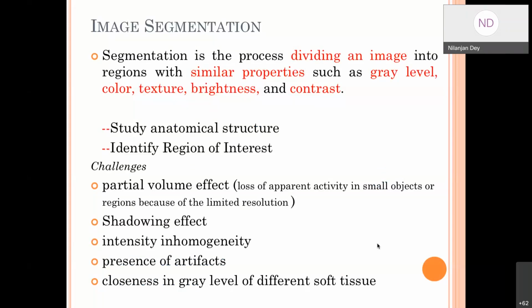Think in this way. There is a drone, it captured the number of vehicles. There is a bus. Within that shadow of the bus, there are 2 bicycles. So the drone was able to capture the aerial image, but it failed to detect 2 cycles because they are within that shadow region of the bus. So until you remove the shadow, you will never be able to find out the exact number of vehicles. Same thing. You are putting a probe, and the probe has one shadow, and within that shadow region, until you remove the shadow, you will never be able to find out the calcium.